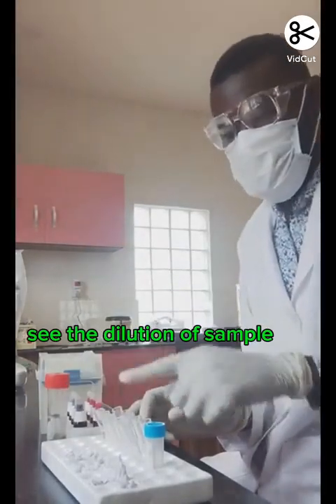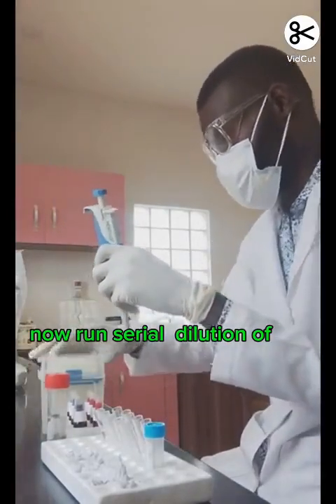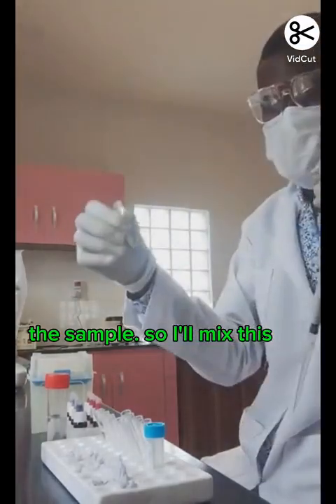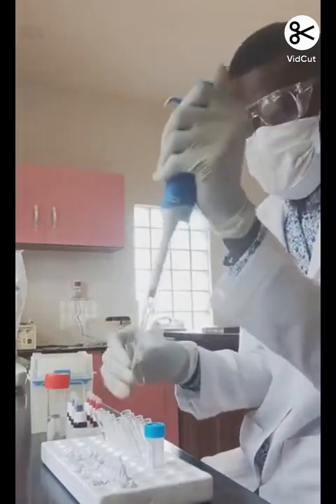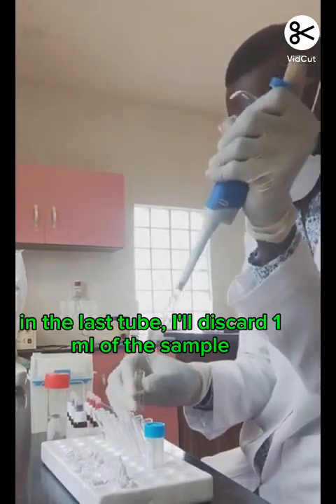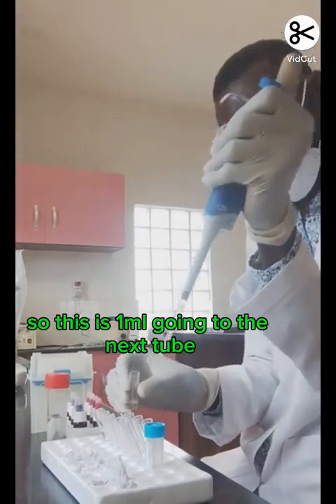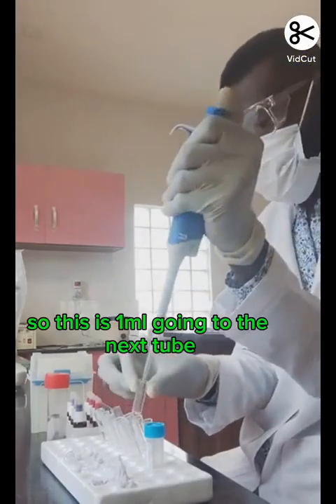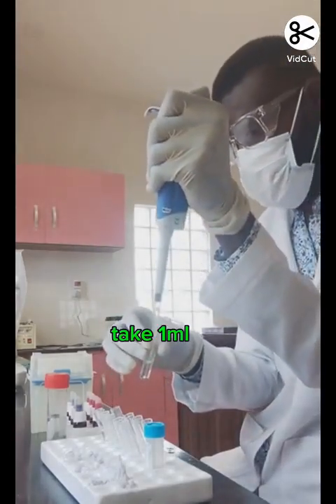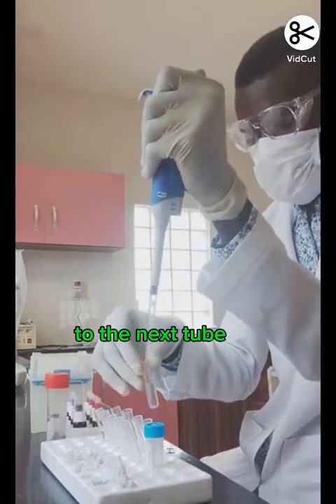Now the next thing is to run serial dilution of the sample. So I'll mix this. I'll take 1 ml from this tube, transfer to the next tube, mix, take 1 ml, transfer to the next tube. In the last tube, I will discard 1 ml of the sample. So this is 1 ml going to the next tube. I'll mix, take 1 ml to the next tube.